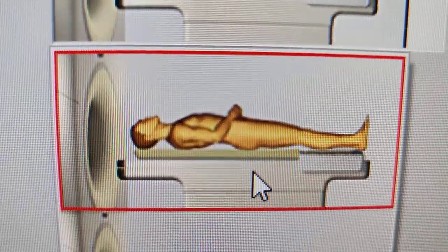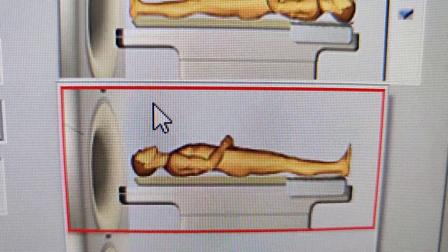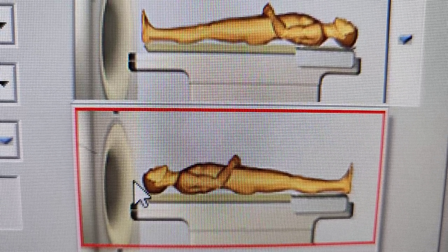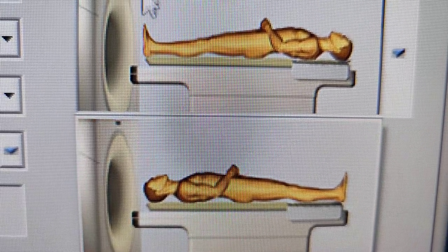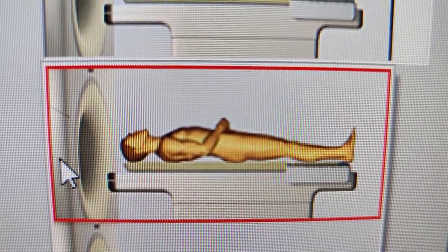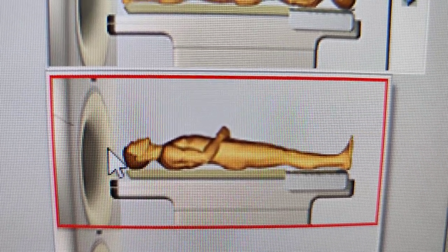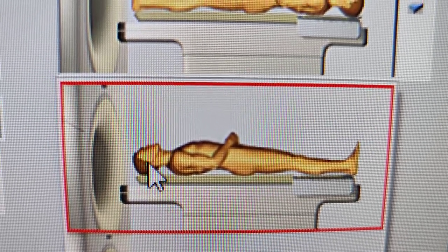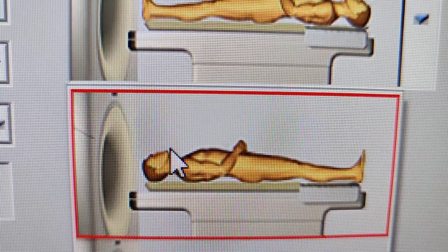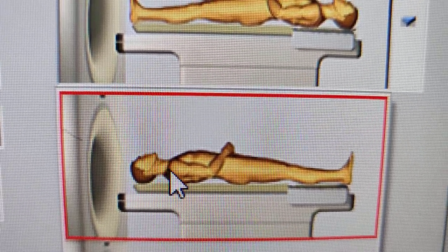This next one is also supine because they're facing up, laying on their back. And instead of feet first, it's head first into the gantry. Normally when we do head first is when we're scanning a head, a face, orbits, anything in the head region, or the neck.